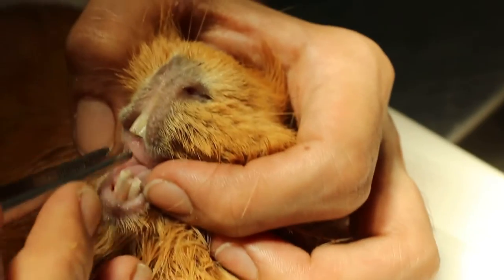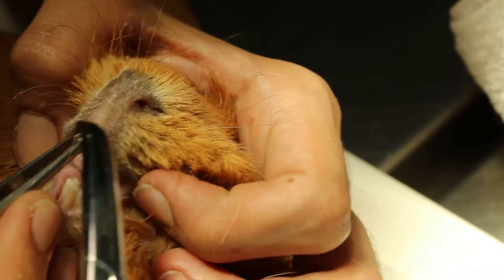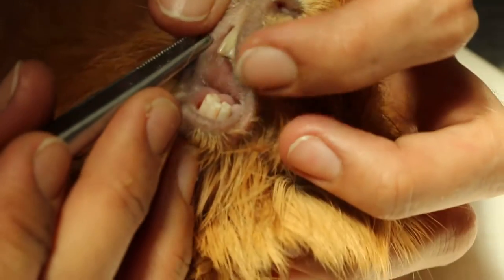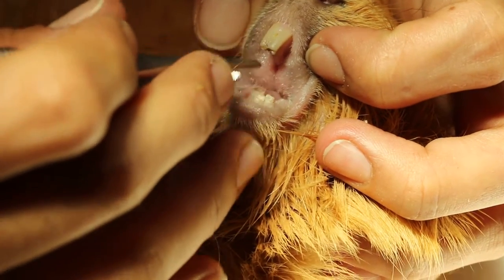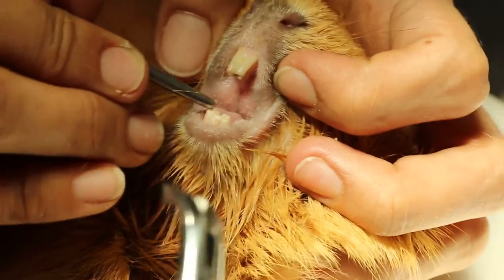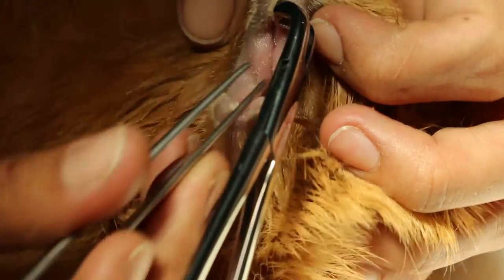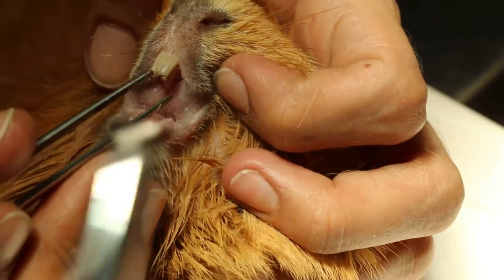We take out the hair in between the front teeth — I think there is some hair stuck between the front teeth. Any hair? Yes, hair stuck between the front teeth. We just use this to take out any hair. No more hair now.